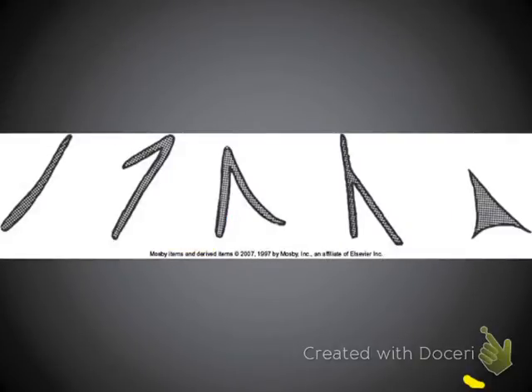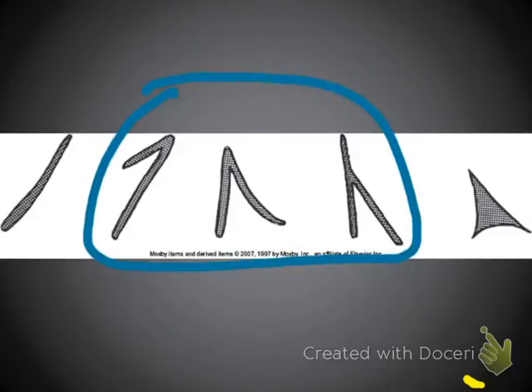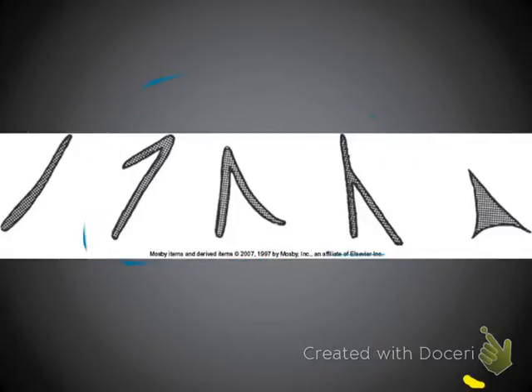Here is what the adrenal glands can actually look like. Many times you're going to see them on CT look pretty much like these. It's been said many times, I've had different radiologists tell me that the easy way to look at the adrenal glands is you look for an upside down Y. And so something like that will be what you see for the adrenal glands.